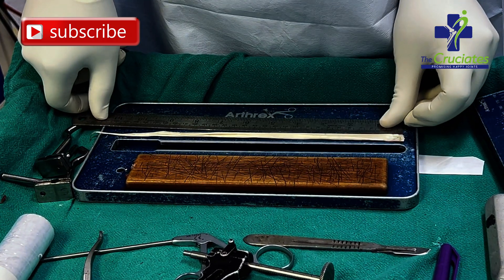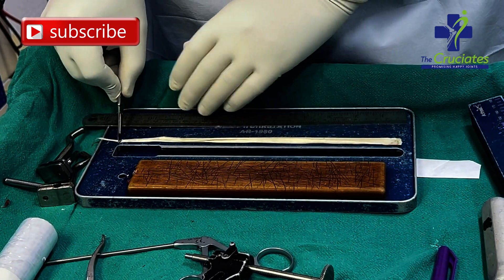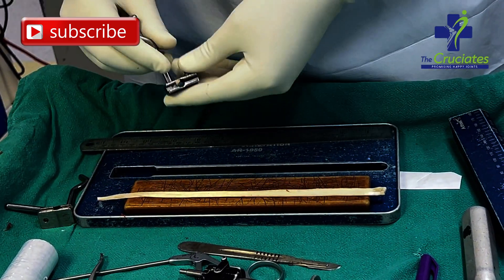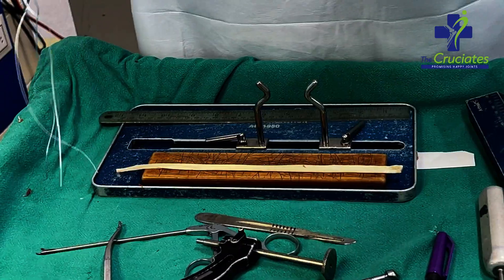After that you have to measure the length of the graft. Ideally it should be at least 26 cm. We need a minimum of 24 cm working length, which finally yields a 6 cm length graft after 4 strands. The remaining 2 cm is used for end-to-end suturing of the graft.